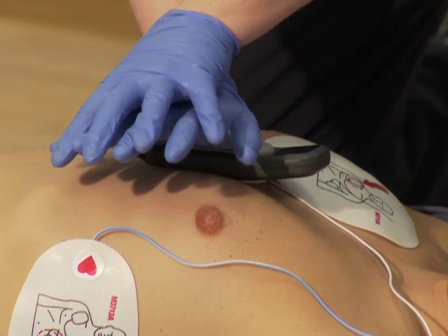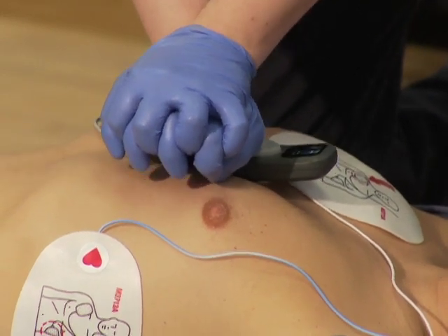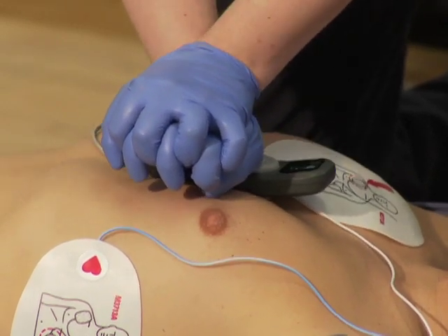It requires use of the pads CPR cable with Philips multifunction electrode pads to measure ventilations, and the CPR meter to measure compressions.